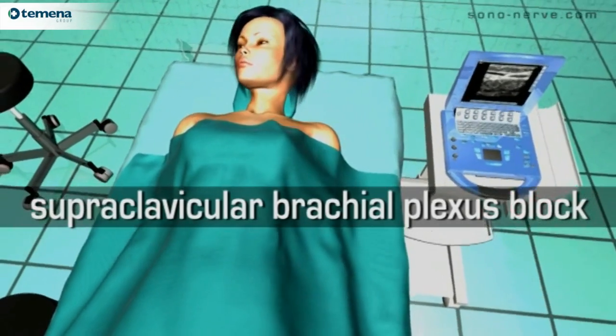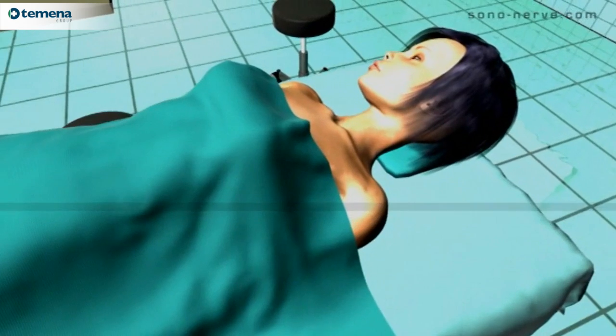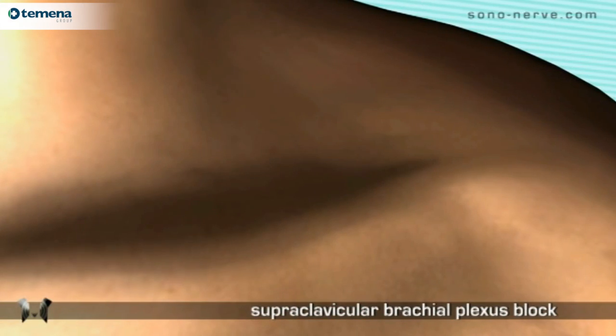Supraclavicular brachial plexus block. The patient is placed in the supine position with the head slightly rotated away from the side of the block.